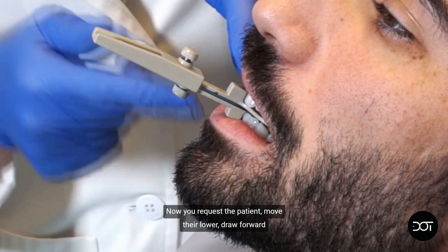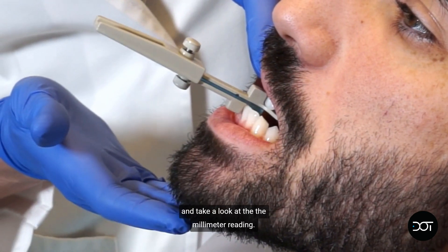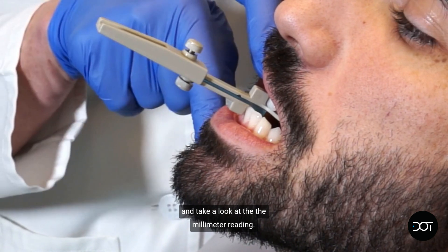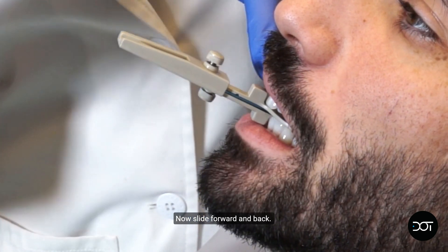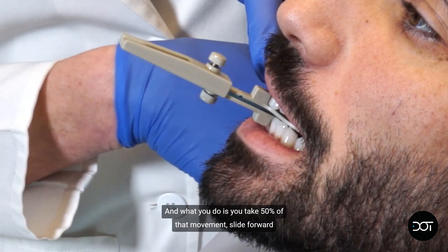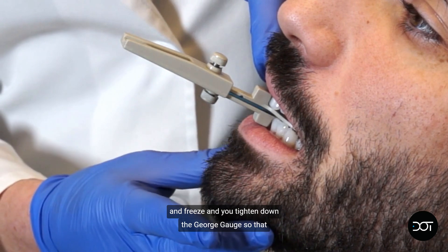Now request the patient move their lower jaw forward and take a look at the millimeter reading. Now slide back as far as you can go. Now slide forward and back. What you do is take 50 percent of that movement — slide forward and freeze.